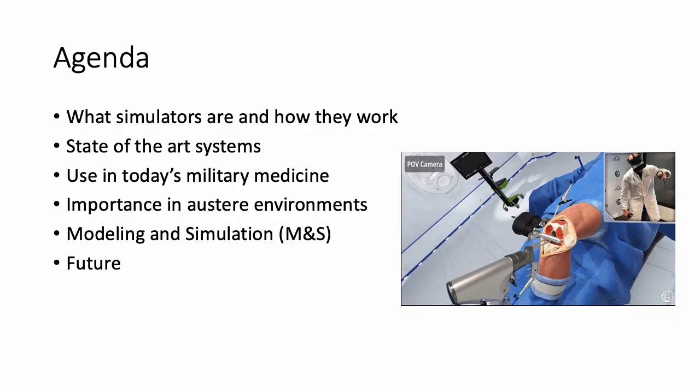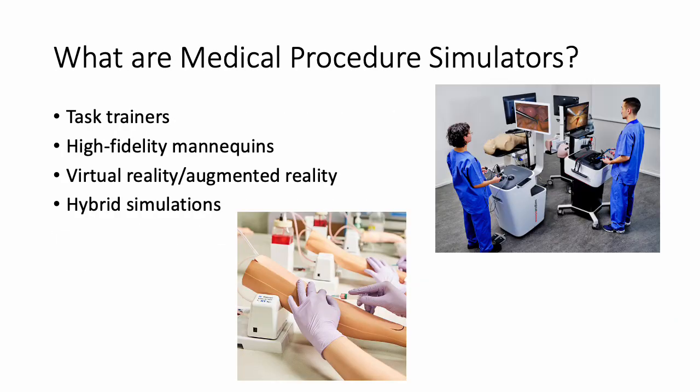This picture on the right shows a medical procedure simulator using virtual reality for a knee procedure. What are medical procedure simulators? There's a spectrum for them, ranging from simple procedural trainers to fully immersive trauma simulation systems.